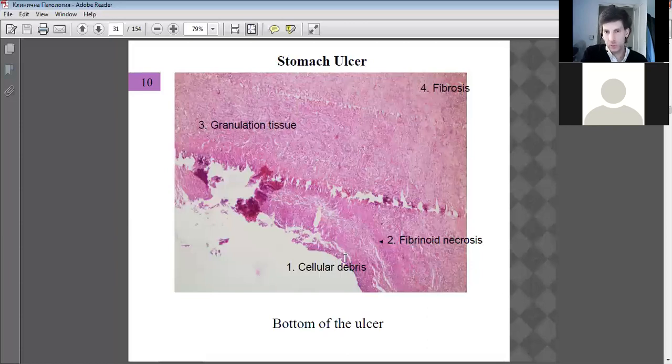But what we can see more is the sloughing of the wall. The wall is breaking down, if you can see that. And as a consequence, the digestive juices are going to start also attacking the rest of the normal sort of granulation tissue, if you like.